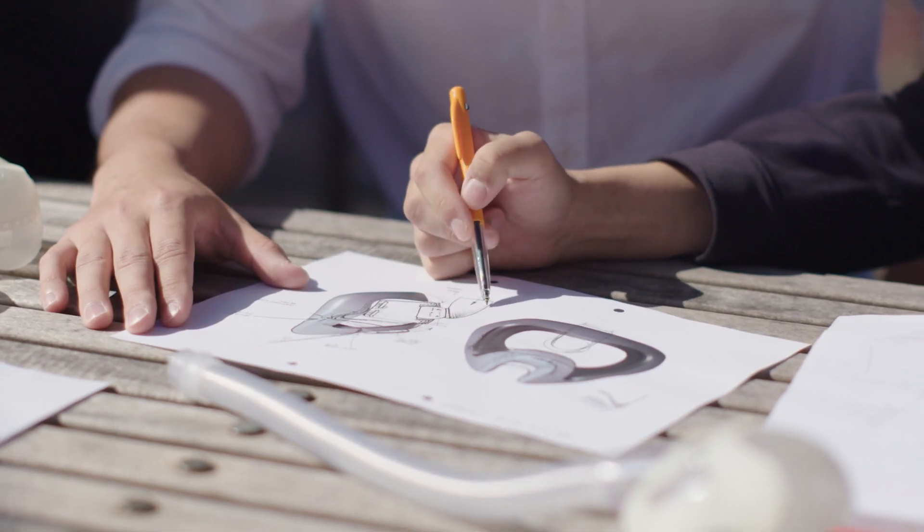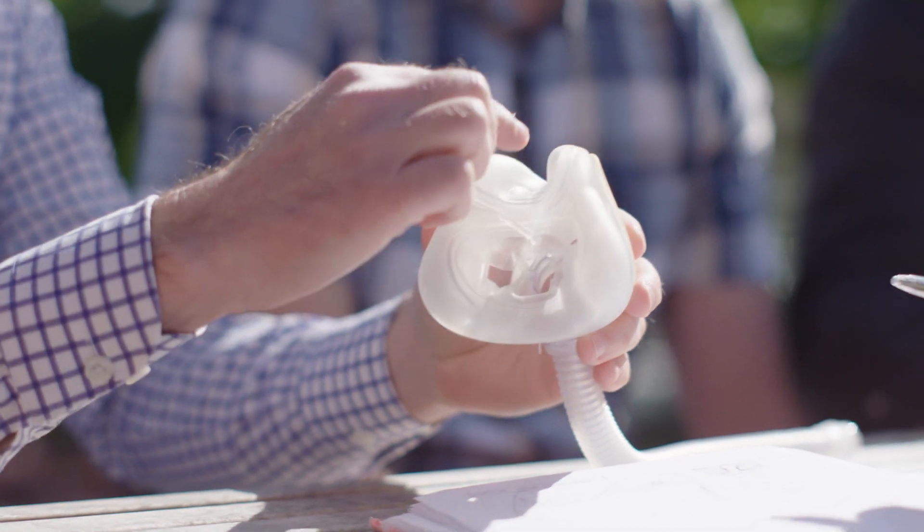With full face masks, they fit over your nose and around your mouth. What we were trying to address with Evora Full was to have a more comfortable solution — less intimidating, it's smaller, fitting underneath their nose and avoiding the nose bridge altogether.